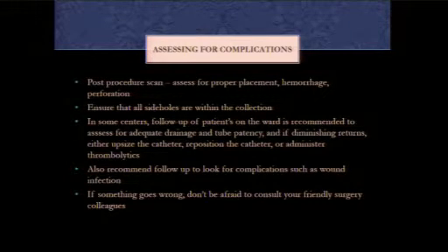So if you're experiencing diminishing returns of abscess, then they recommend either upsizing the catheter, repositioning the catheter, which can be done over the wire, or administration of thrombolytics. It's also a good way to assess for complications of our procedures, such as wound infections. And if things go wrong, such as perforation or bleeding that you can't control, don't be afraid to consult surgery.